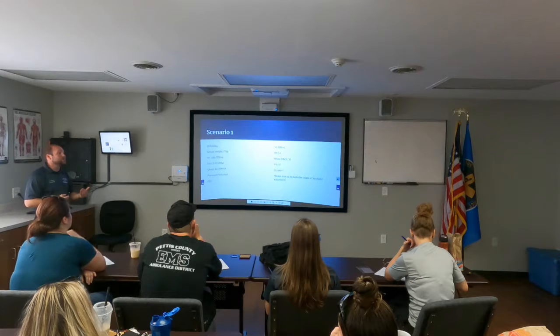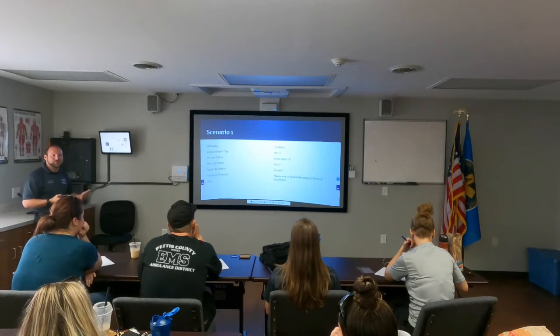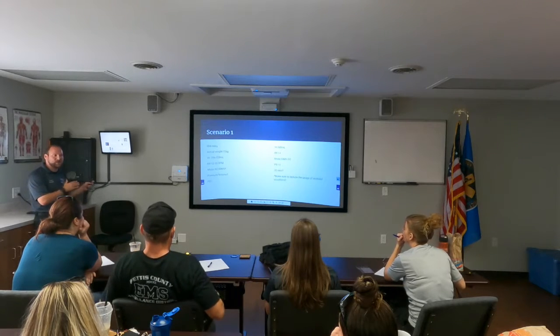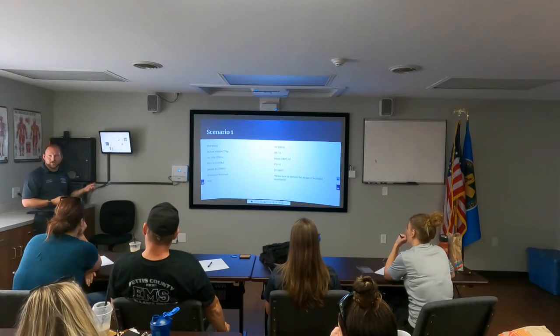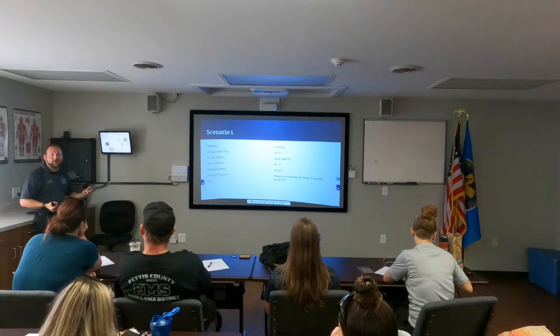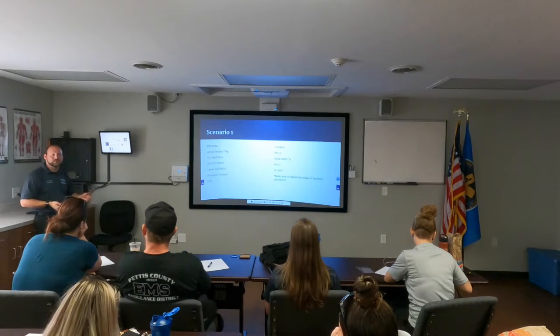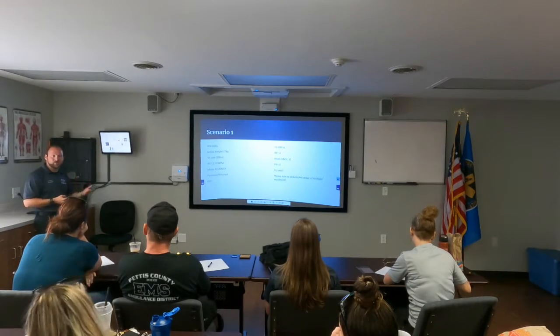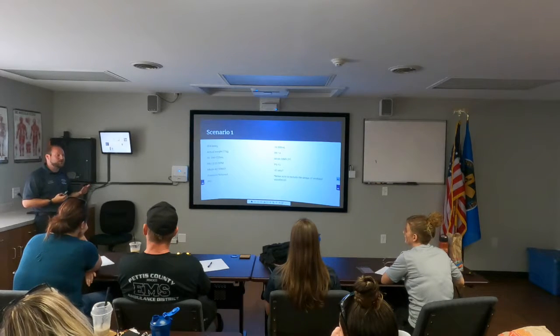Make sure we are always using our end tidal waveform, gold standard for any intubation. Every patient on the vent should have end tidal attached to it. You can attach end tidal to CPAP and BiPAP. I've done it on myself, it works. Just know that the number you're going to get is going to be slightly lower than what the actual number is. Just keep that in mind when it comes to your BiPAP patients if you're using it as far as making the adjustments that you want to.